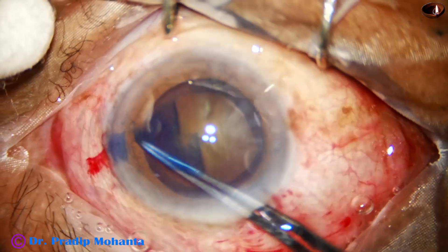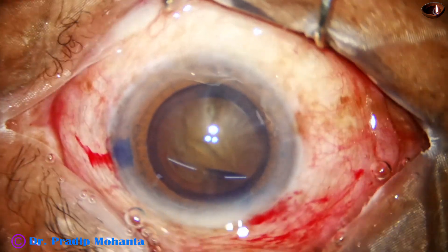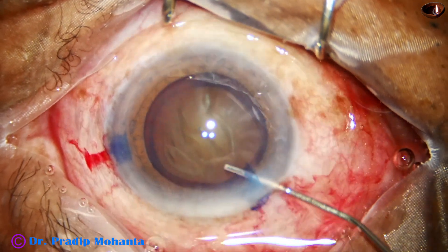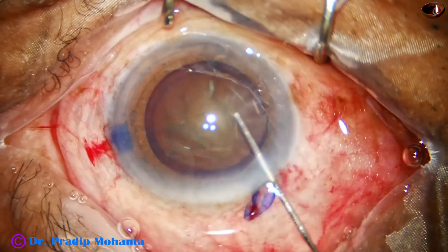Remember, in hard cataracts you must do a large rhexis — at least 5.5 millimeter. Don't do a small rhexis. Nucleus management will be very tough if you do a small rhexis.